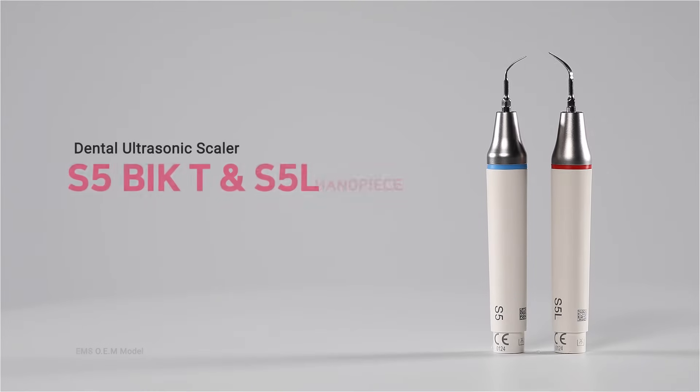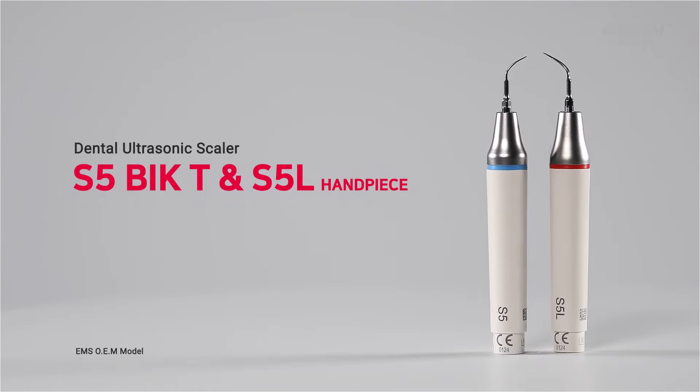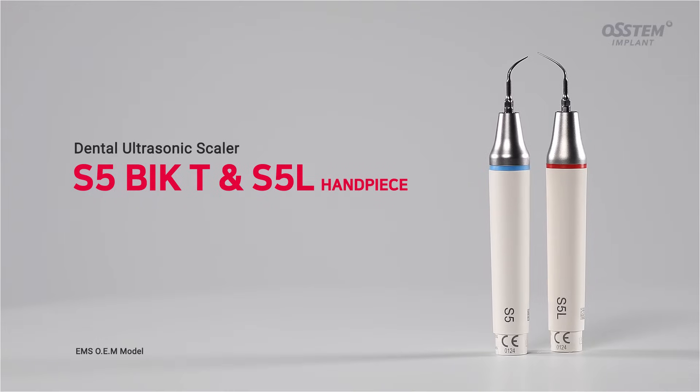Introducing the S5T and S5L Scalar, premium ultrasonic scalers made in Switzerland.